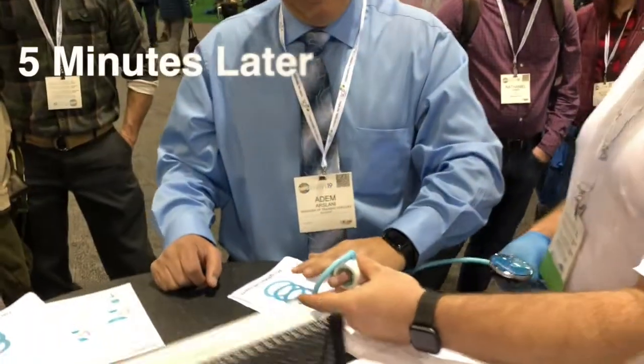Do you have any pain or discomfort right now? No pain — I feel the pressure but it's not painful. And that's the maximum pressure that you feel. We're going to deflate and slide this off.